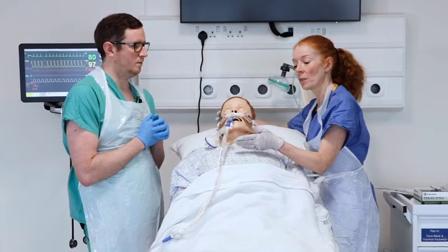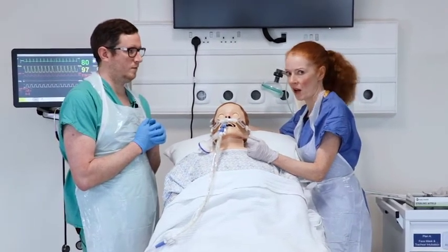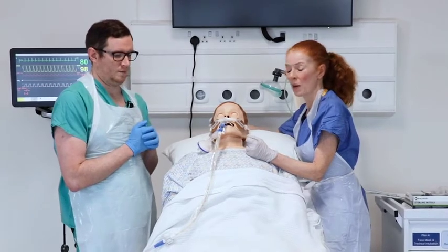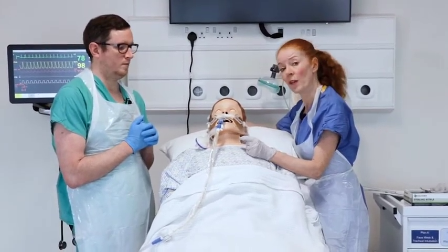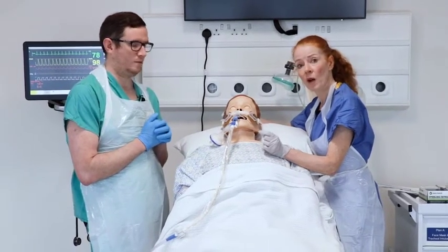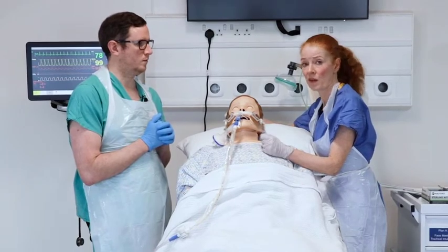Until the patient gets used to an endotracheal tube, suctioning is very uncomfortable and patients don't like it. So it is always worth considering whether they might need a small bolus of analgesia or sedation before you proceed with the suction.